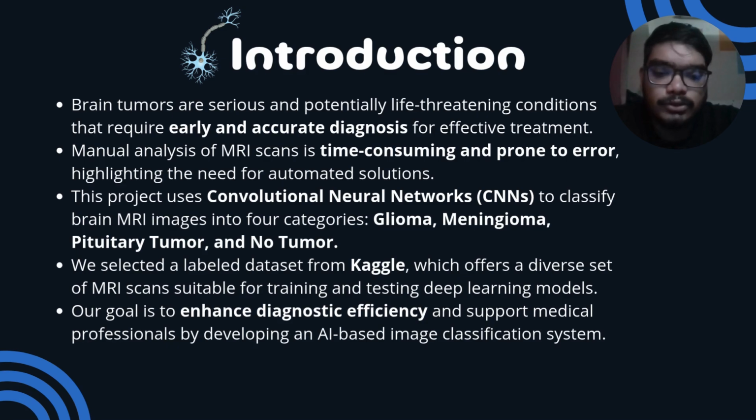Our project aimed to automate the classification of brain tumors using convolutional neural networks (CNNs), a powerful deep learning technique well suited for image analysis. CNNs can automatically detect and learn visual features from MRI images, helping identify different tumor types.